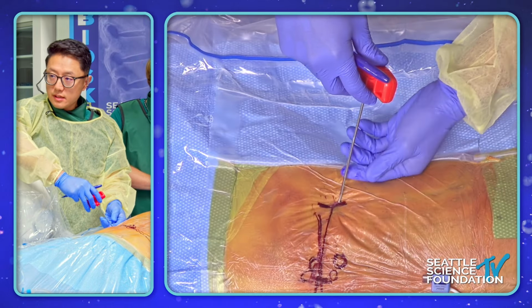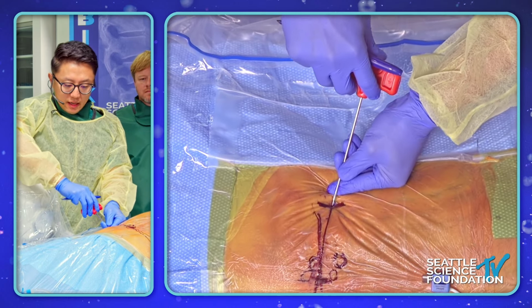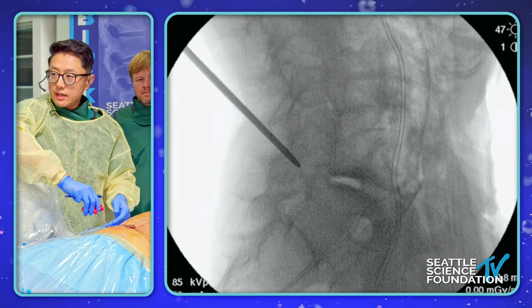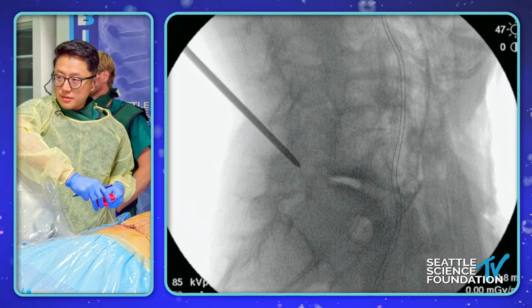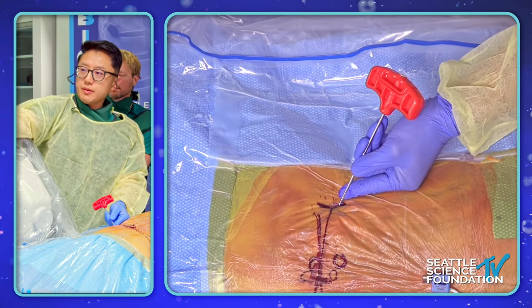How much are you relying on your tactile feedback to help you guide your instrument? A lot. I mean, that's the thing. You've got to feel for the bone, and then utilize your X-ray at the same time. This is going to be a bit of a challenge because of the rotation. See a shot there? And then, actually, do you mind flipping the C-arm?